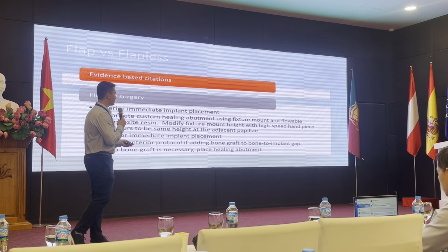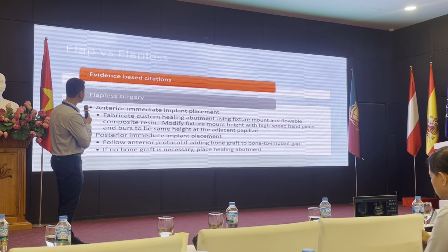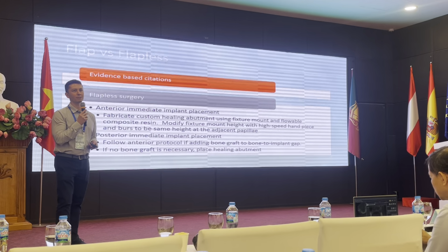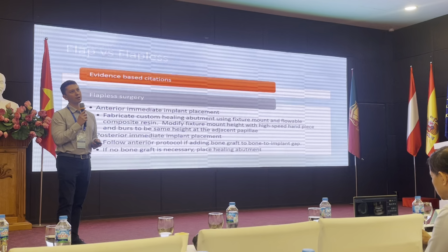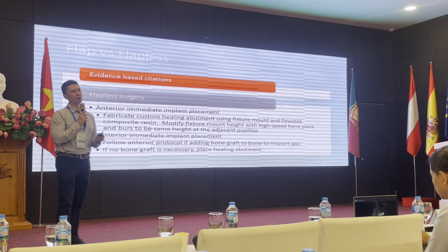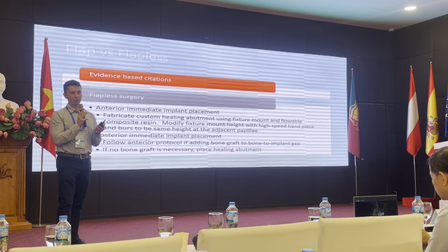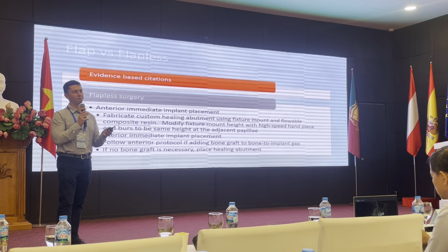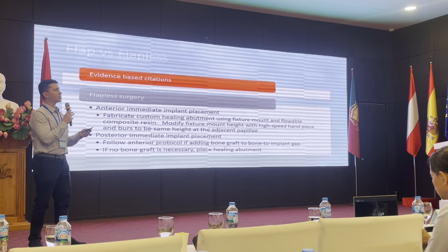And in other cases where there's abundant soft tissue, maybe flapless technique makes sense, but it's very important to get comfortable reflecting a flap. Creating a flap is very, very important. And no matter how small or how big the flap is, they'll all heal, but you have to make sure that you're comfortable and that you make a plan on how to create the incision for your flap, and then how you're going to close the flap.